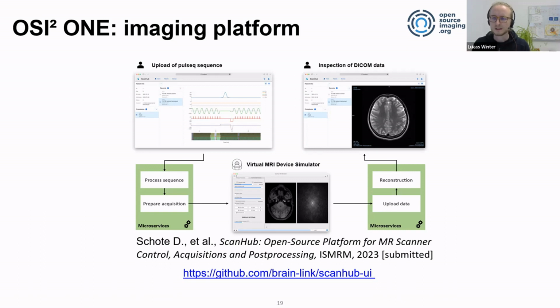So there are a lot of tools. And then, of course, once you have some standardized formats, you can also use some open source post-processing tools. So the nice thing about having such an imaging platform in the cloud is you don't need heavy reconstruction computers locally, and you can connect the community around the systems to further develop, but also to learn about this type of system. So this is where the directions are going software-wise.